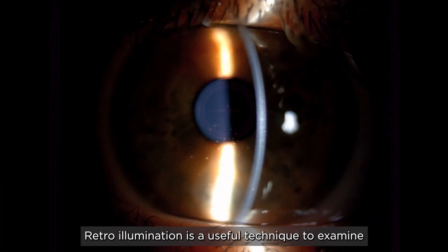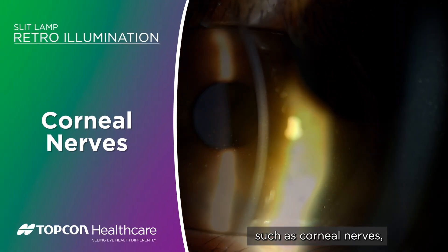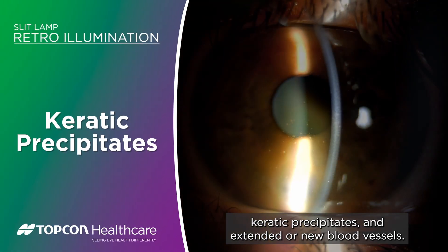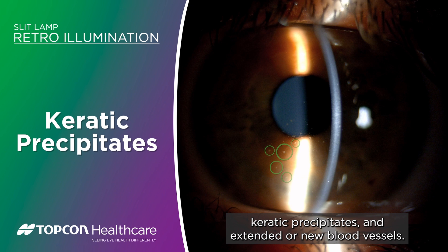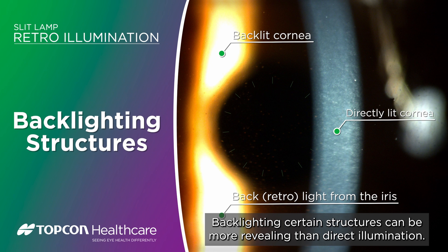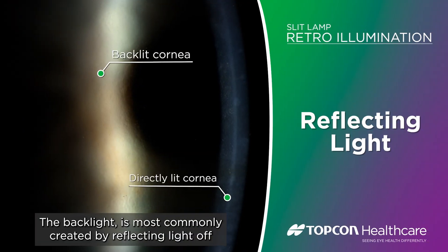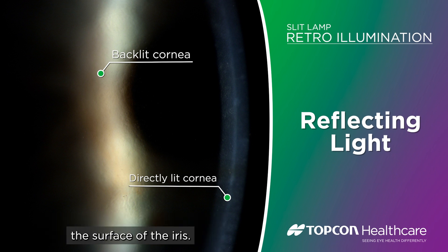Retro illumination is a useful technique to examine low contrast structures on the cornea such as corneal nerves, keratic precipitates and extended or new blood vessels. Backlighting certain structures can be more revealing than direct illumination. The backlight is most commonly created by reflecting light off the surface of the iris.